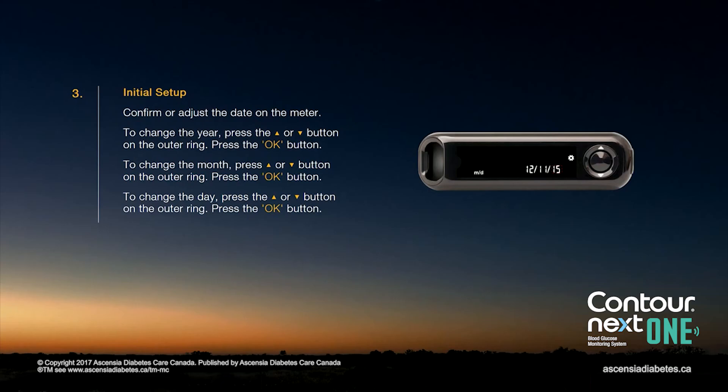Confirm or adjust the date on the meter. To change the year, press the up or down arrow button on the outer ring, then press the OK button. To change the month, press the up or down arrow button on the outer ring, then press the OK button. To change the day, press the up or down arrow button on the outer ring, then press the OK button.